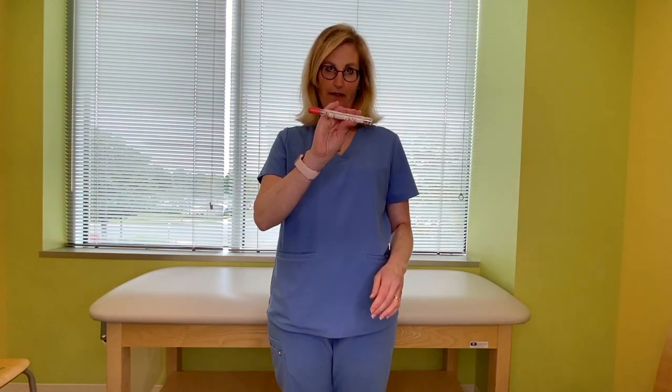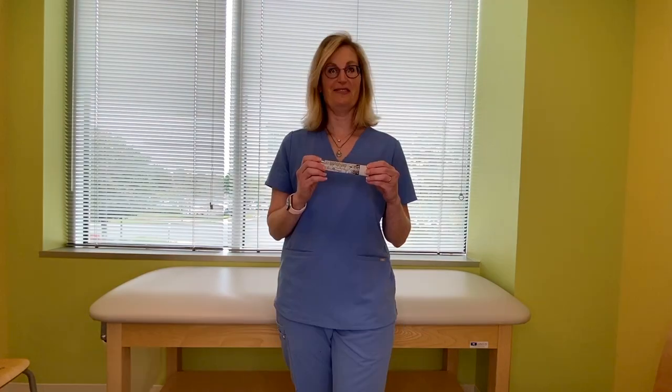Count 1, 2, 3, 4, 5, 6, 7, 8, 9, 10 — pull it out, massage, call 9-1-1. And that's how you use this device. Thanks for listening.